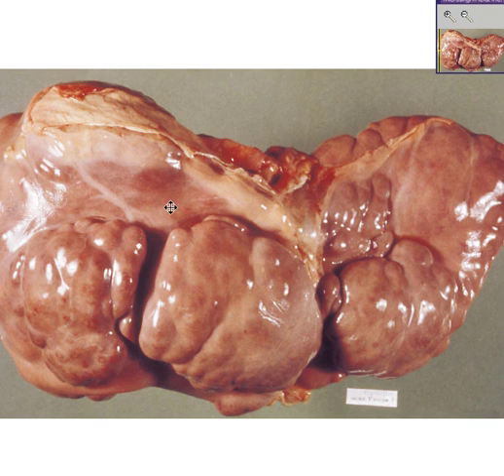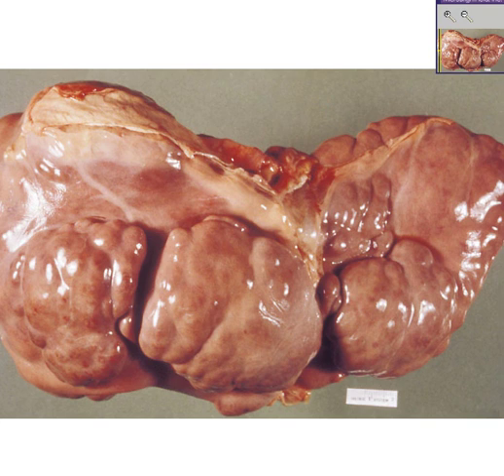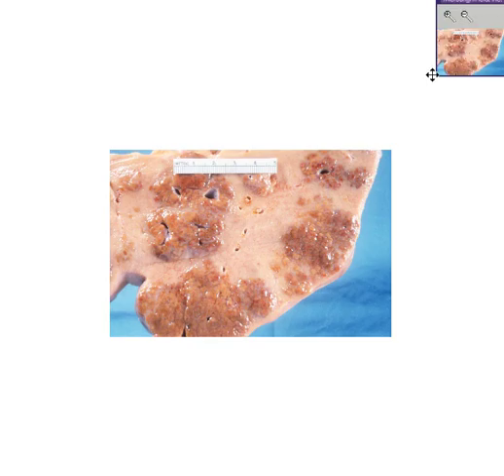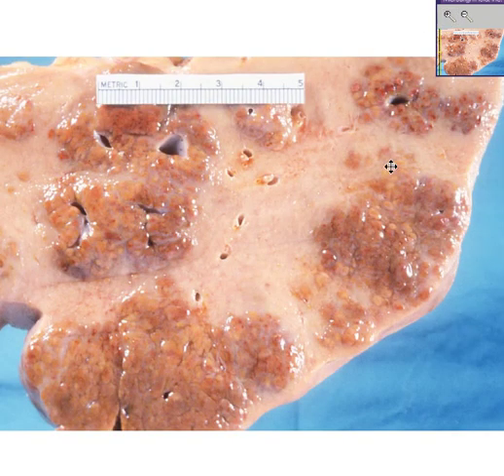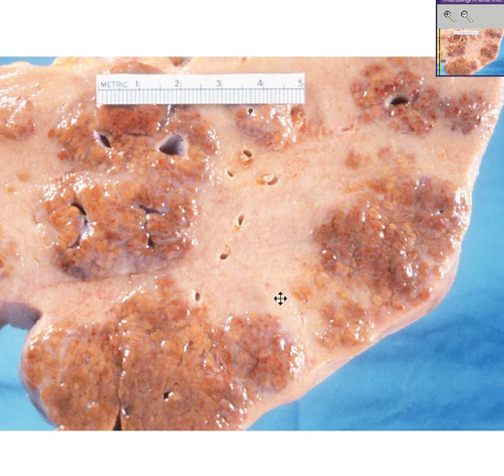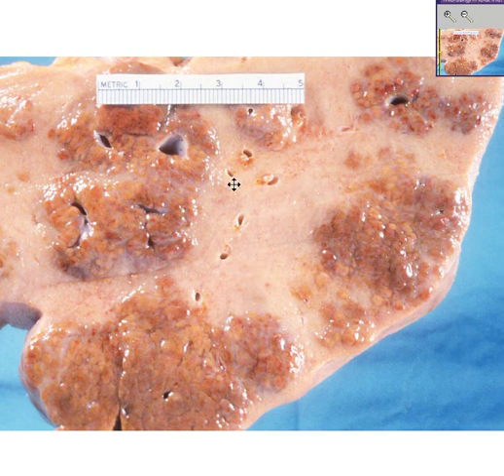This is a liver that is not smooth — it is very nodular. Here's a cut surface of that same liver, and it is also nodular. You can understand why it's nodular because there are a lot of regenerating liver nodules, which are the brown areas, and there is a lot of dense scar tissue, which are the white areas.